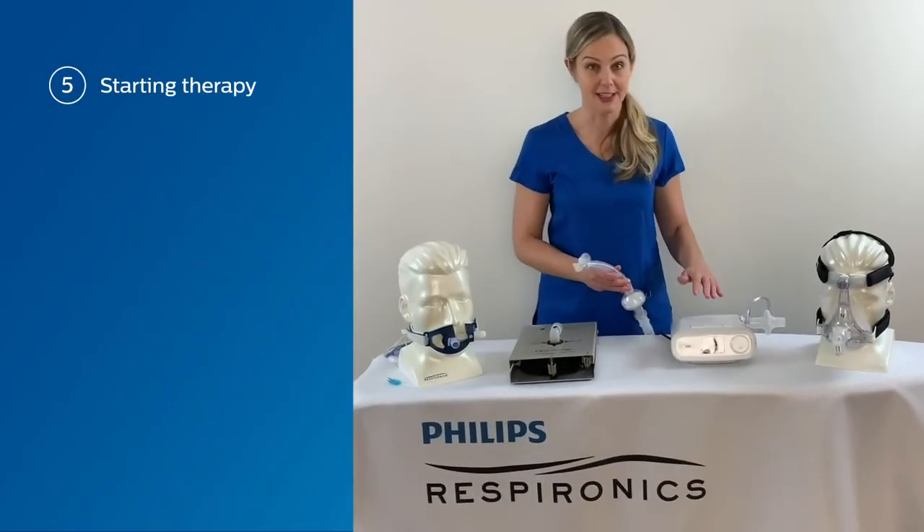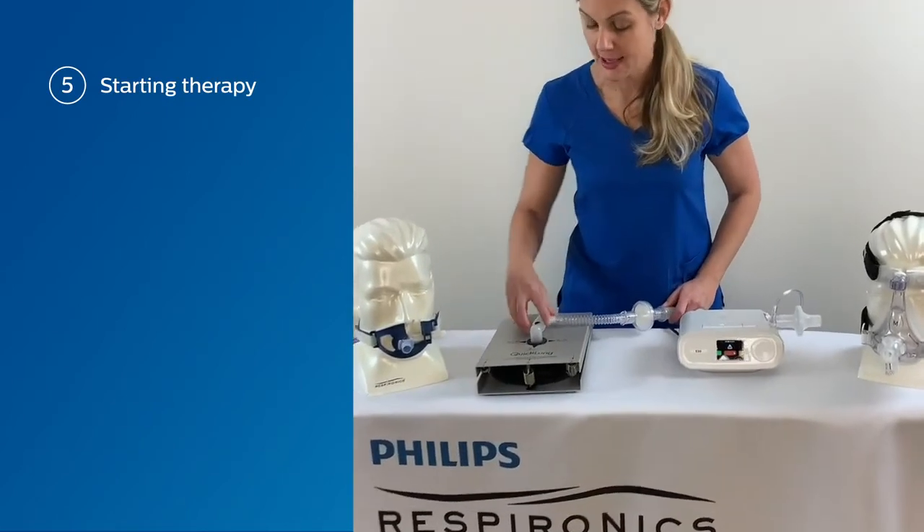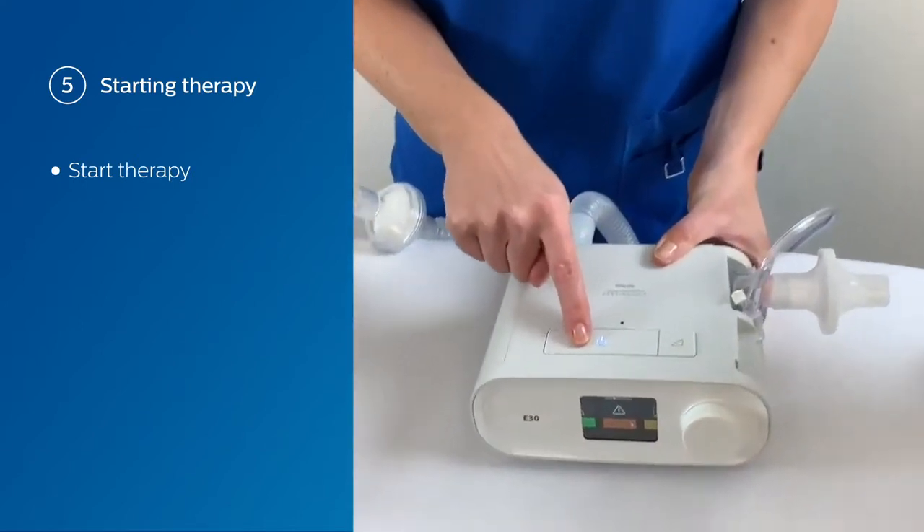Now that we've set up the device and our circuit, I'm just going to connect to a test lung and we're going to start therapy. To start therapy, all you have to do is press the on-off therapy button.